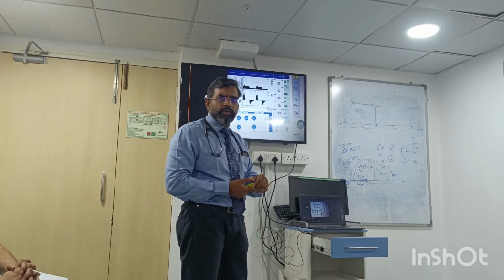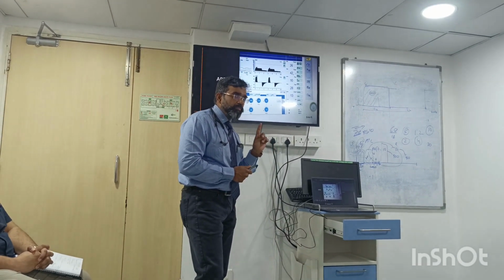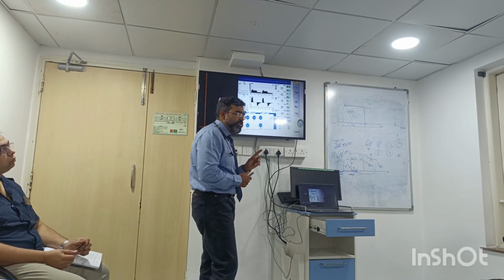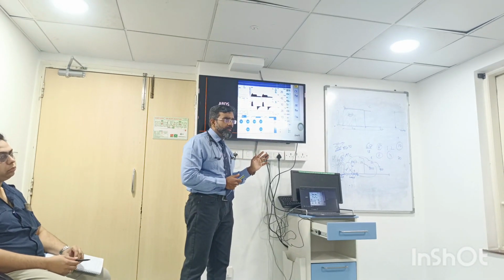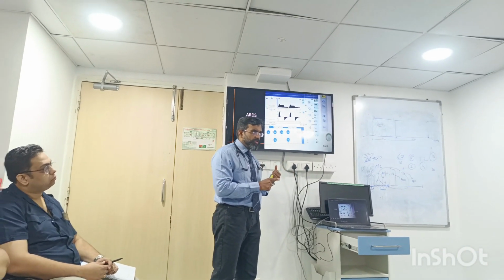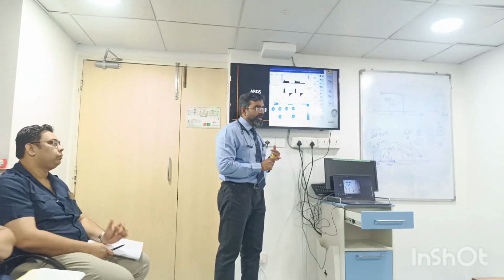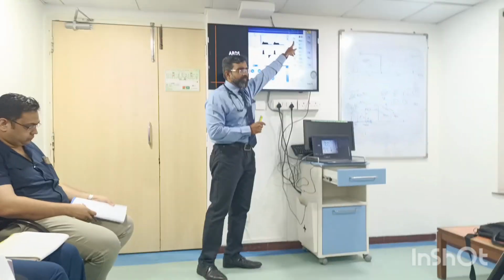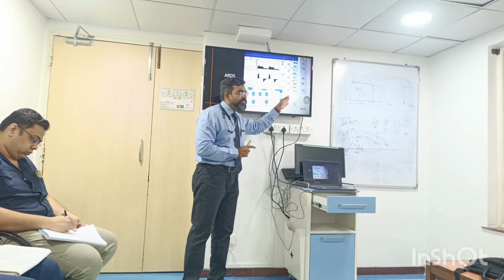Clear? So ARDS ventilation is not easy. Not easy at all. What have you understood from all these things, Amit? What have you understood in ARDS ventilation? What I must see on my left side: pressure, peak pressure. I want to see my most important plateau pressure. I want to see my minute ventilation, because that keeps on changing. Third thing, what I want to see: my mean airway pressure. And fourth thing, what I want to see: my total frequency.